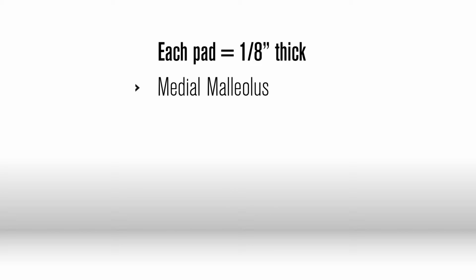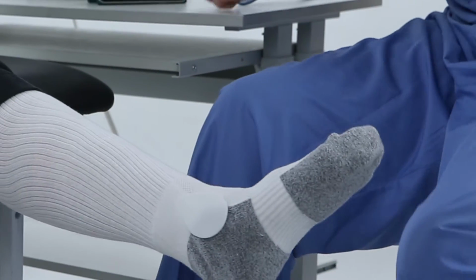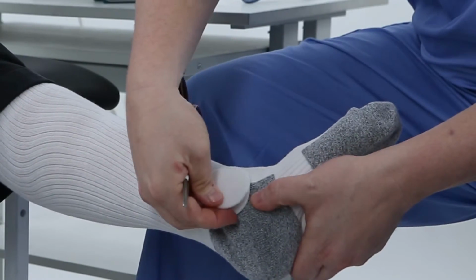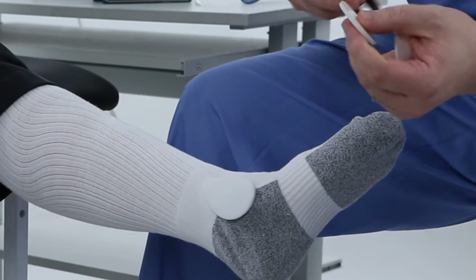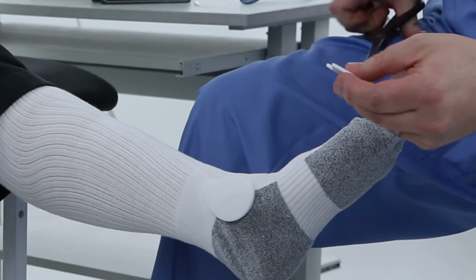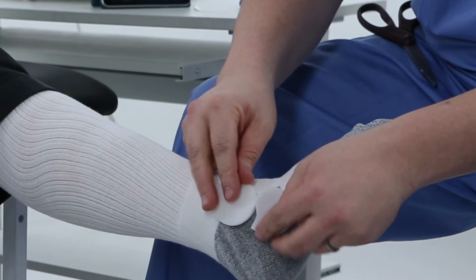The standard locations for relief pads include medial malleoli, lateral malleoli, base of the 5th metatarsal, navicular, and Achilles tendon insertion. Determine how many pads are needed and what bony prominences to cover for an ideal fit. For bony prominences other than the malleoli, you may trim the relief pad to the desired shape and size.